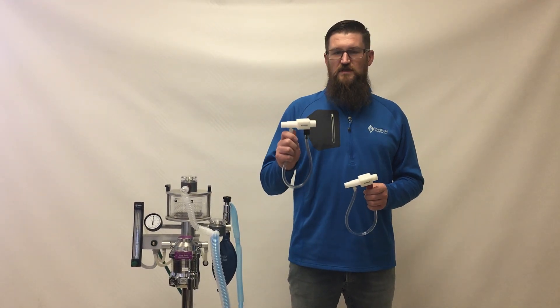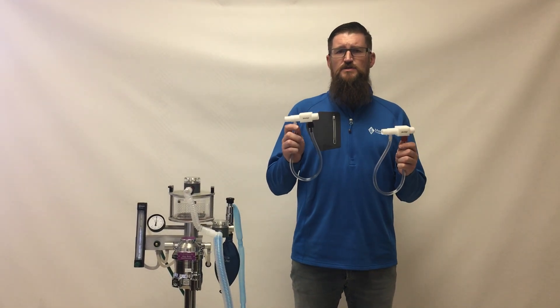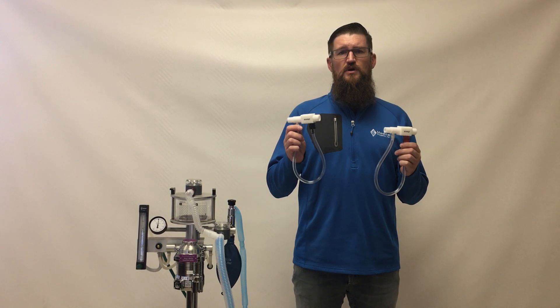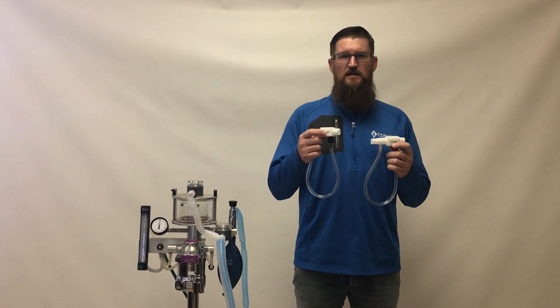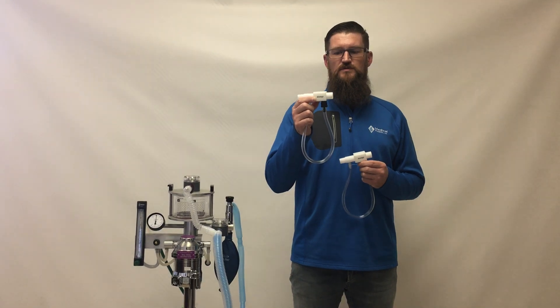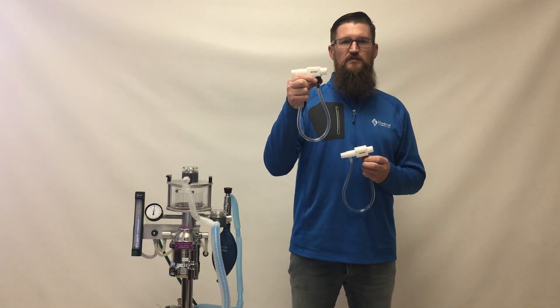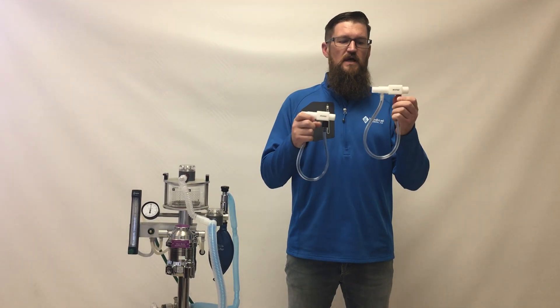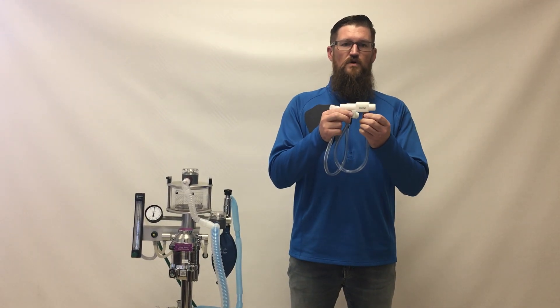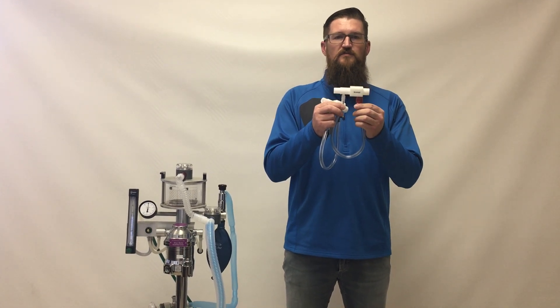The JDM Safety 20 and JDM Safety 30 safety pressure relief valves are designed to relieve circuit pressure above their indicated pressure rating. The JDM Safety 20 is rated for 20 centimeters of water pressure and is indicated by the black relief valve. The JDM Safety 30 is rated for 30 centimeters of water pressure and is indicated by the red relief valve.